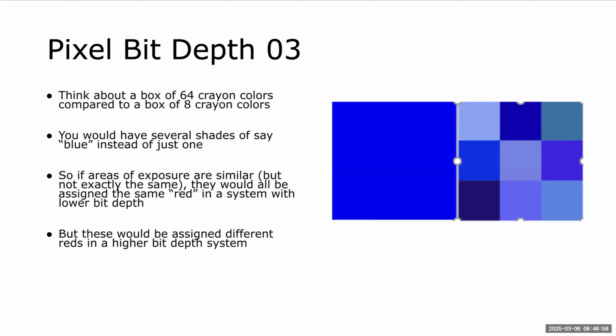So the higher your contrast resolution is in your system, the better, because it means you're going to be able to see more information in that image than if your bit depth is lower. That's the bottom line.